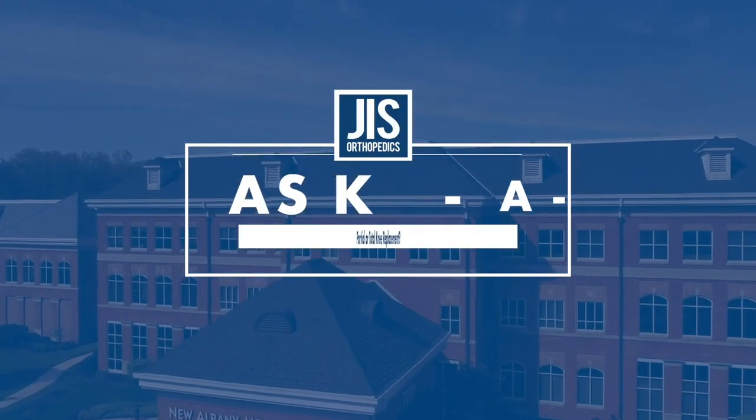I'm frequently asked, well, what is the difference between a partial and a total knee replacement? Well, it is exactly that. In a partial knee replacement, the surgeons are just replacing the inside part of the knee where the bone-on-bone arthritis is, and leaving behind the normal structures and the normal cartilage on the outside, the kneecap, and the normal ligaments. In doing so, it's a much less invasive or minimally invasive procedure to have a partial knee replacement.